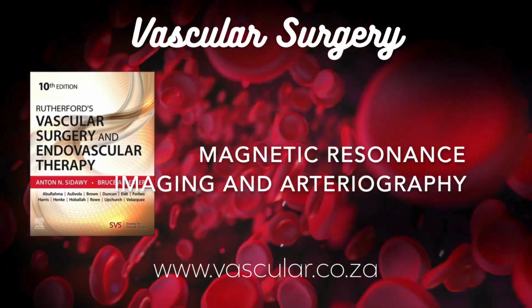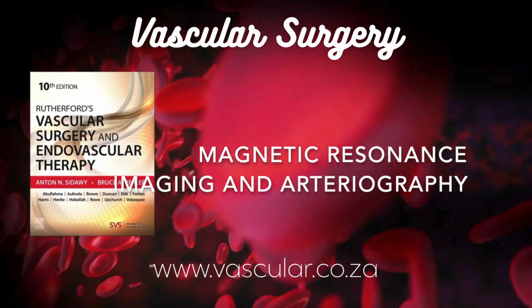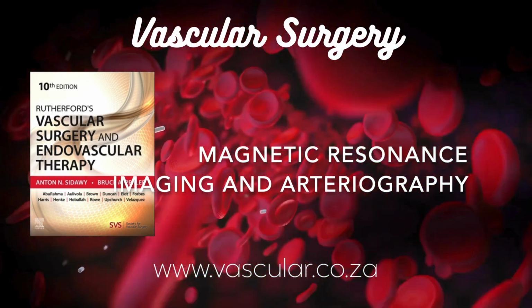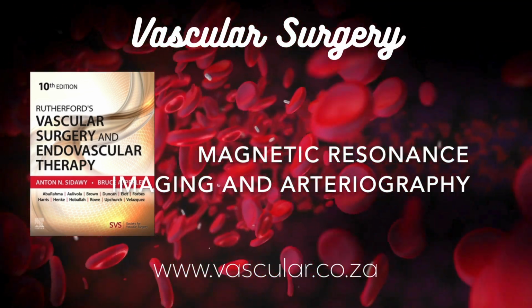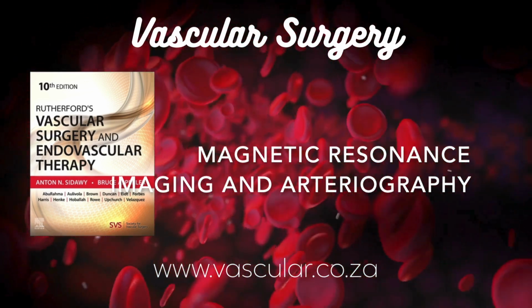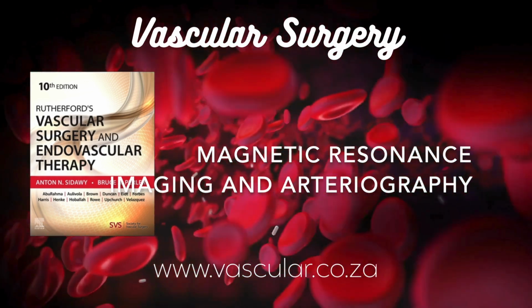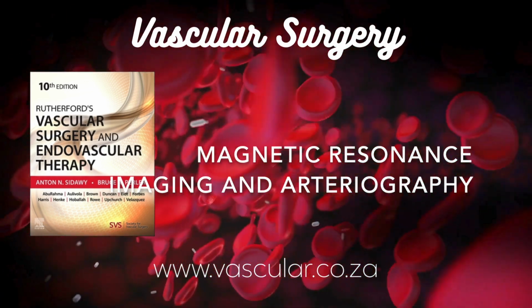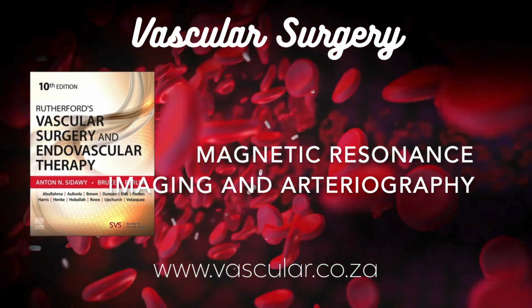Now, what about the hardware and software needed to do top-notch MRA? What makes a good MRA setup? For optimal MRA, you really benefit from having higher field strength systems, ideally 1.5 or even better, 3 Tesla. These should be equipped with fast, strong magnetic field gradients, multi-channel RF receivers and coils, and importantly, powerful computers for image reconstruction. Why are all those components important?